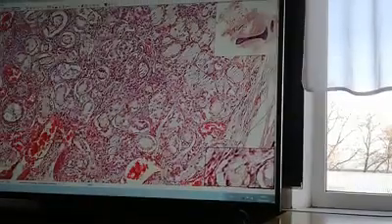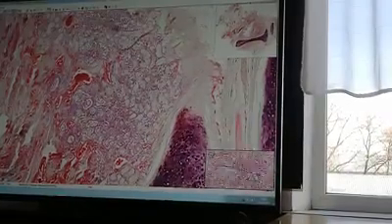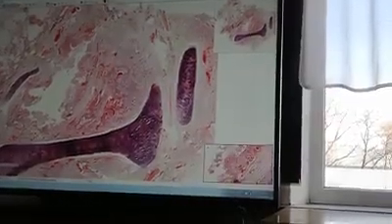After that, we can find an area of sclerosis. You know that in chronic inflammation, doesn't matter where it is, in this case it's the bronchus but it can be anywhere, chronic inflammation is accompanied by lymphohistiocytic infiltration, and also sclerosis, all the time. So we can find a severe sclerotic process in the bronchial wall: masses of connective tissue, collagen fibers, and elongated fibroblasts. And also, the last change in this preparation is changes in mucous glands. You know that in the wall of large bronchi there are a lot of mucous glands which become hyperplastic in case of chronic inflammation. So in chronic bronchitis, we can see hyperplasia of the mucus secreting glands in the bronchial wall. All glands which produce mucus are hyperplastic. So chronic bronchitis: a lot of changes in one particular bronchus.